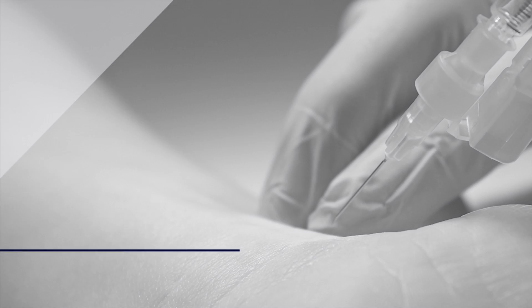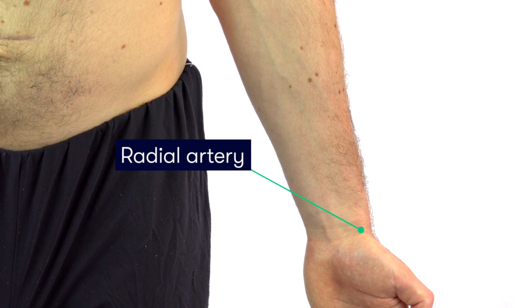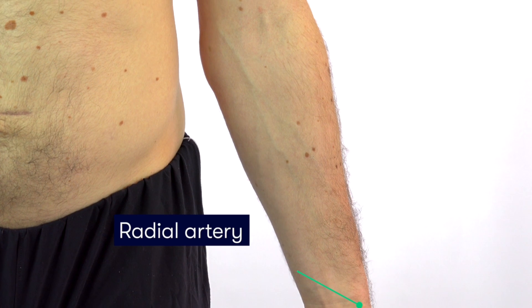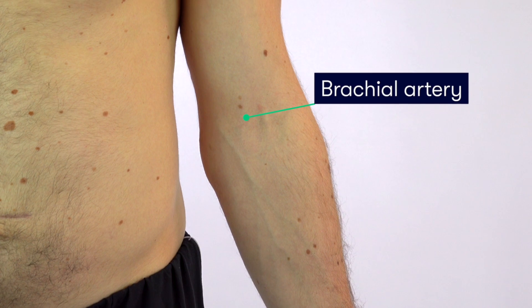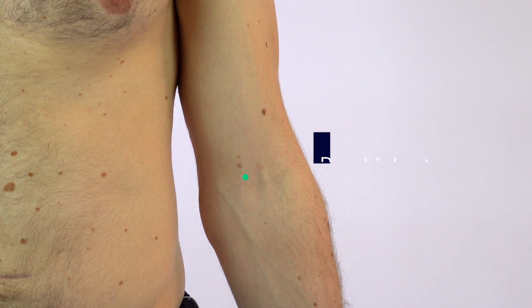Because of the superficial nature of the radial artery, this is the most common location from where we obtain the sample. However, if there are concerns regarding the use of this site, then the brachial or femoral arteries may be used, but we won't be demonstrating the use of these sites in this video. As with all procedures, we start by introducing ourselves, then checking the patient's identity, explaining the procedure, and obtaining their consent.